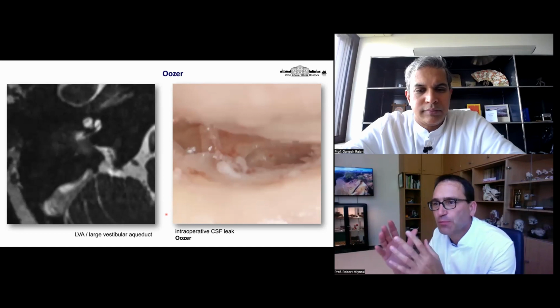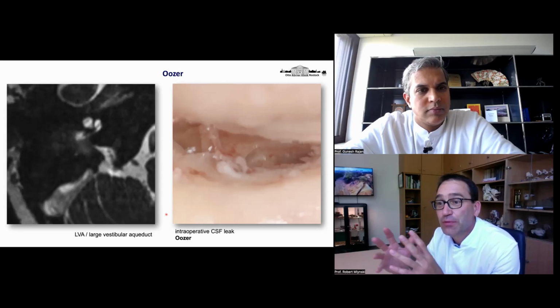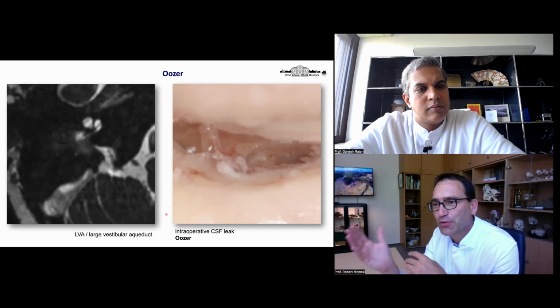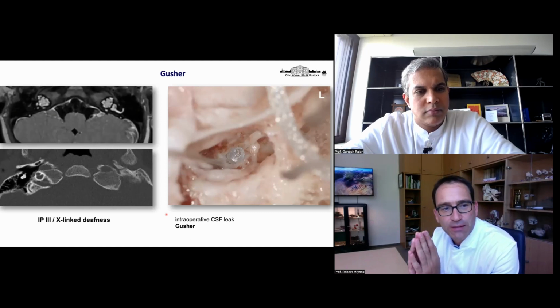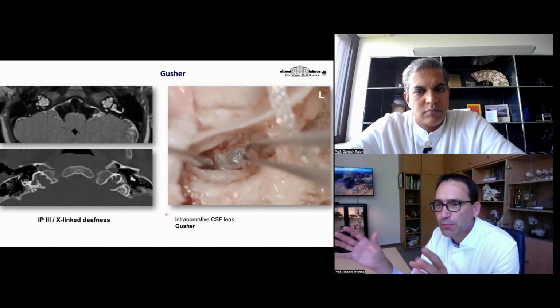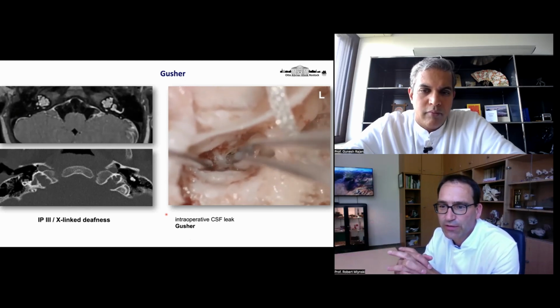This is the tricky part, because if you have a malformation, let's say IP2 or IP3, then you sometimes need smaller electrodes and you don't know what to do. Will it fit in? You can, of course, check with the Autoplan in advance. But we also have the malformation electrode. So there's quite a portfolio where you can choose how to approach this individual case.